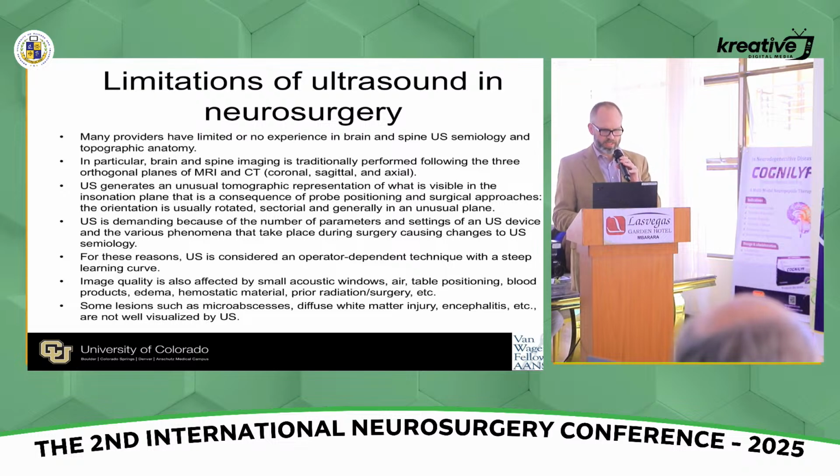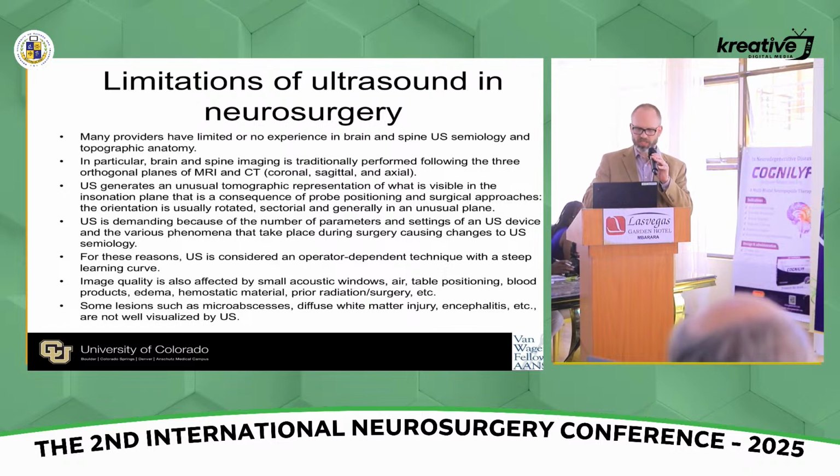Well, ultrasound, we've already talked about that, so we'll move on. It's demanding because you can have a board with 100 different buttons, and that can be intimidating, but it really comes down to just a few key things that need to be adjusted.